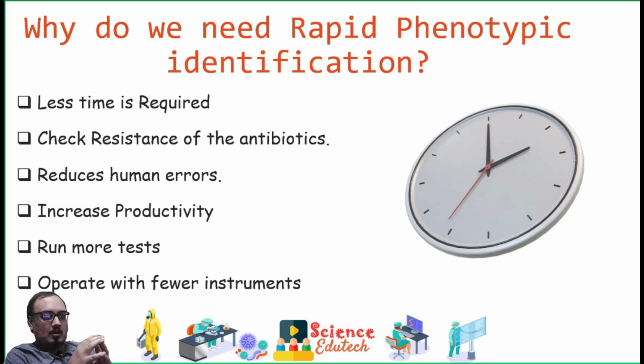Phenotypic methods offer a huge advantage over genotypic methods in that they can identify a wide range of types and detect the resistance currently expressed, despite the genetic variability in resistance-associated detection.